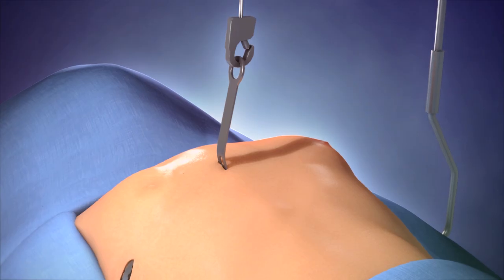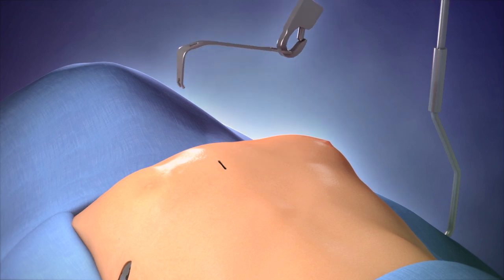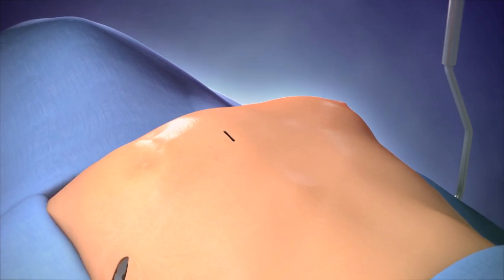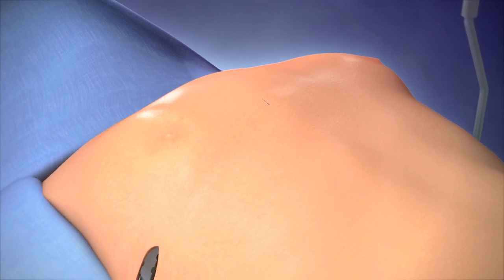The chest is now totally corrected and ample space is available for the lungs and heart. All incisions are closed with sutures that are absorbable.